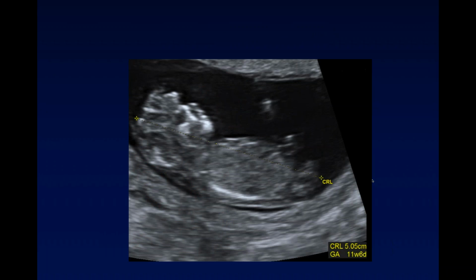What about this baby? This baby should have been 12 and a half weeks gestation, came in, you do your crown rump length, it's 11 weeks, 6 days, which we can do an NT on this. Certainly we do them between 45 and 84 millimeters. What catches your eye? Take a good look. The profile is a little unusual, but what about the head? You don't see a cranium.